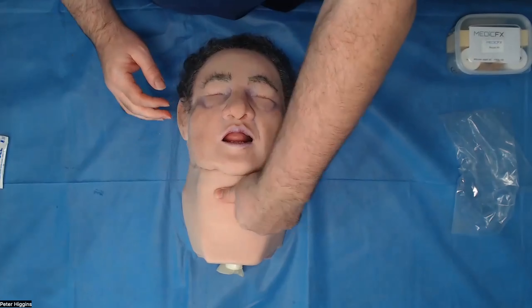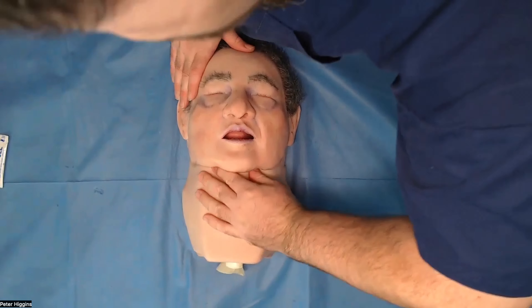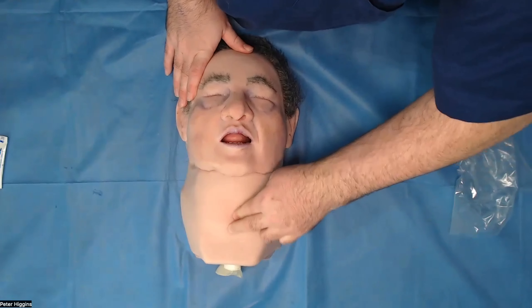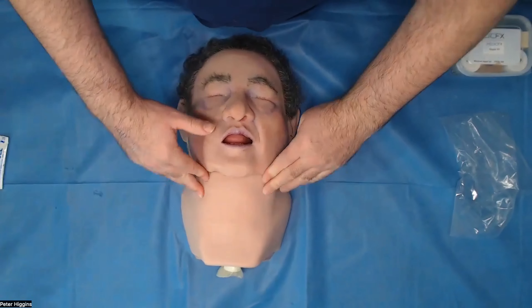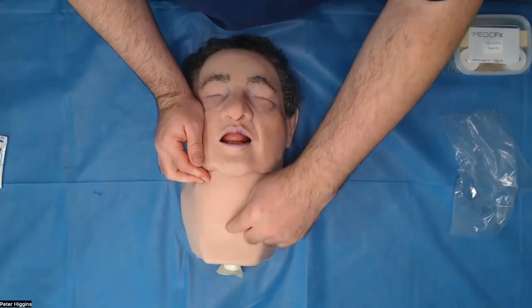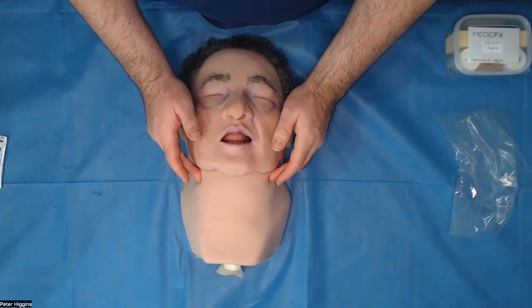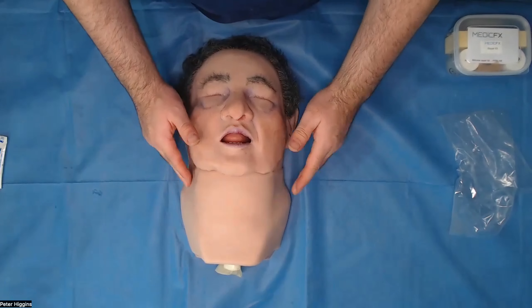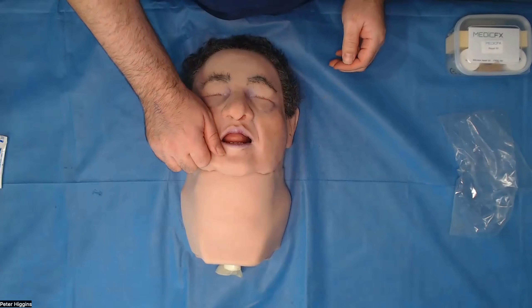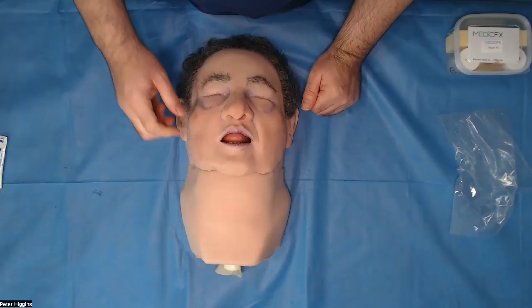He's got a difficult to palpate neck, so performing a laryngeal handshake will be really, really difficult. Trying to find all of your landmarks again is going to be quite tough. So this is the kind of patient where you will probably just make a big incision in the centre there, blunt dissect down with your fingers until you can get to the right spot, and then insert your ET tube using a bougie and a scalpel.